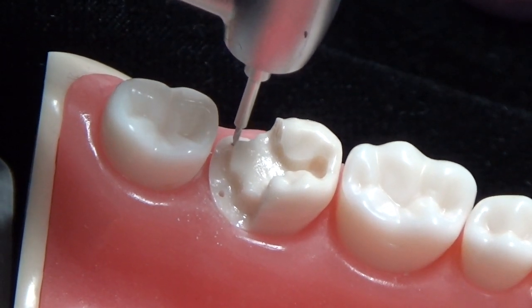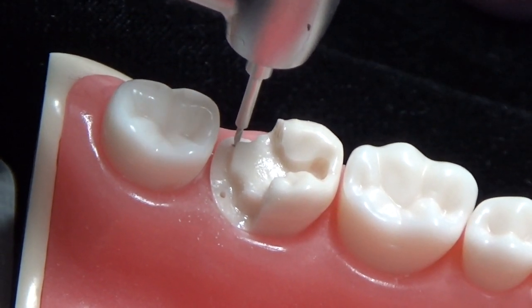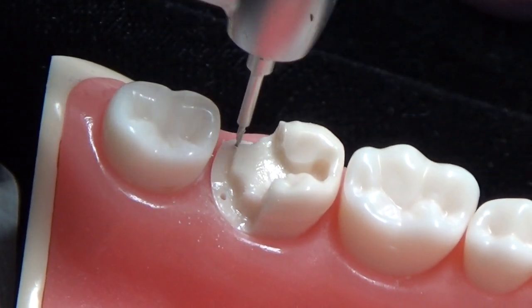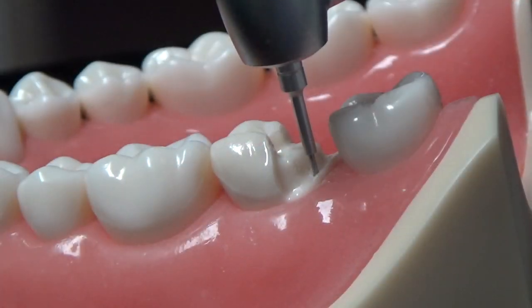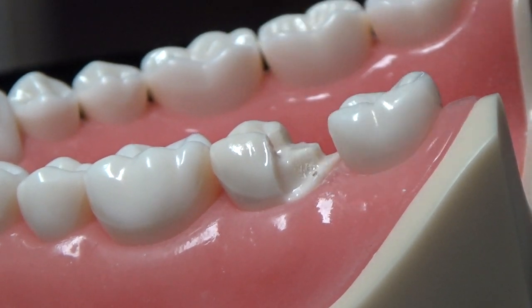Now I'm going to do the same thing on the buccal distal. I'll check my point of entry, lock in my path of draw, and go ahead — that's it, one time.